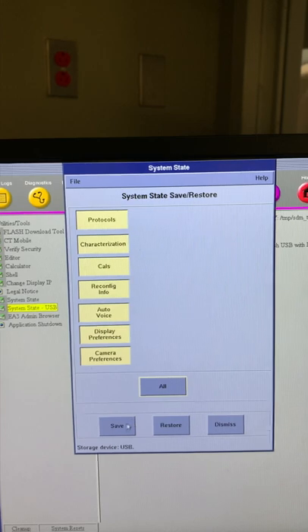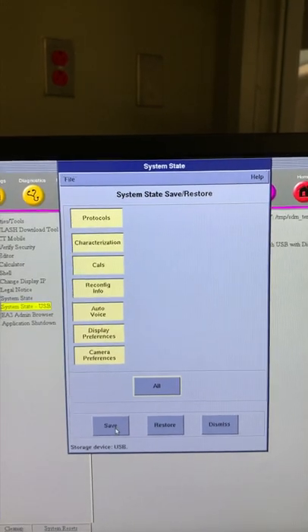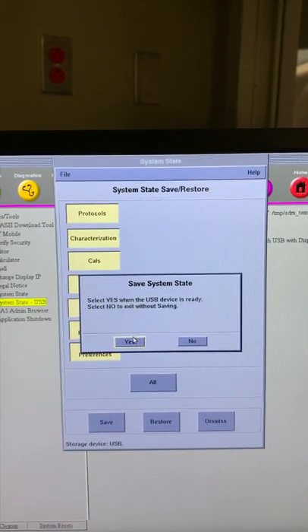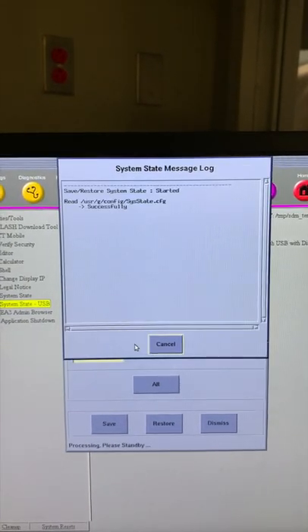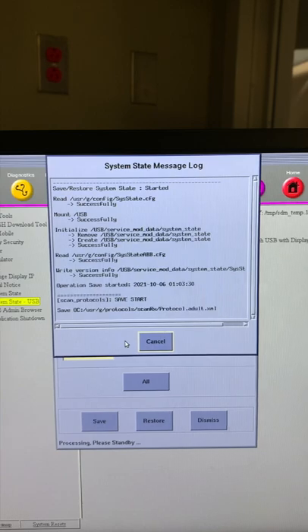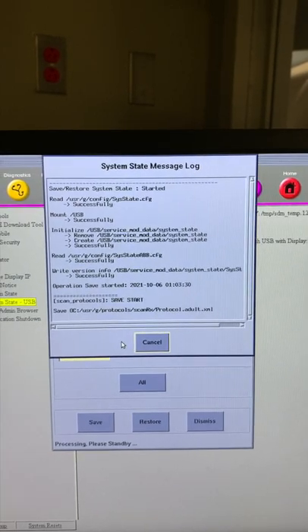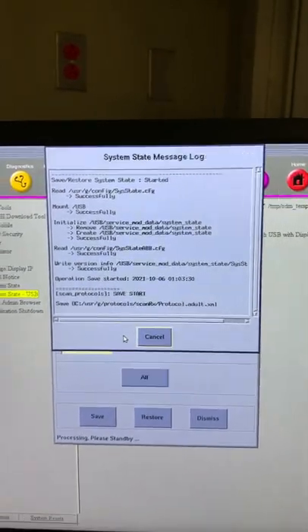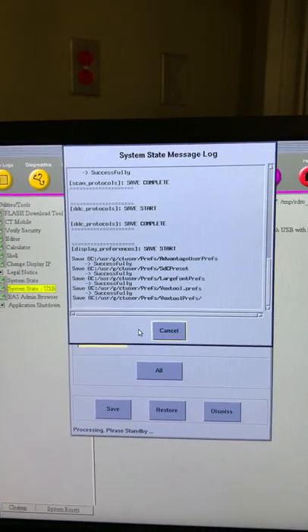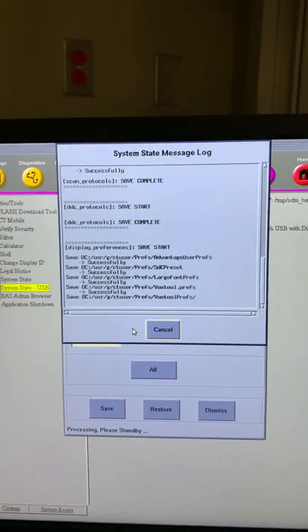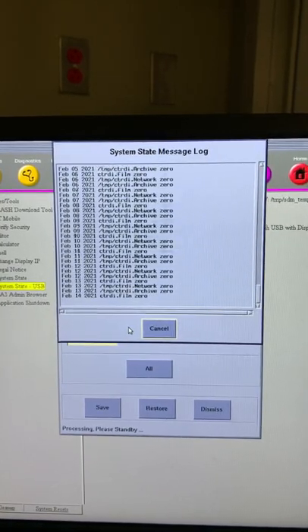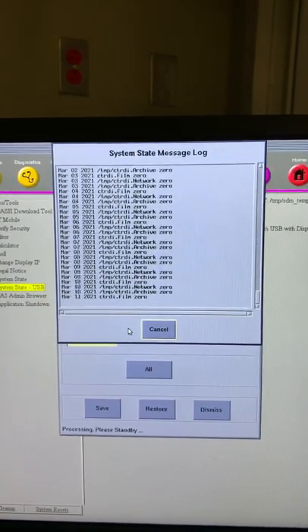A new screen will populate giving users the option to customize which state files to save to USB. Select the protocol option if you wish to only save the CT protocols to the USB, or you can select the all option to save the entire system state file.